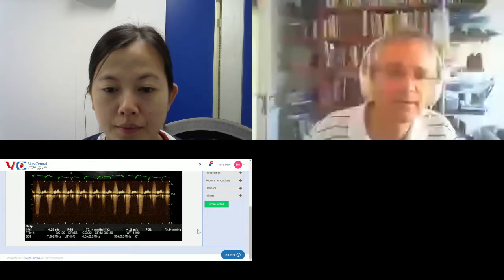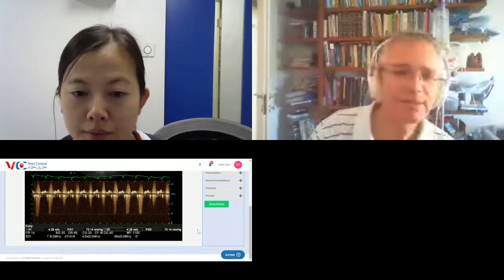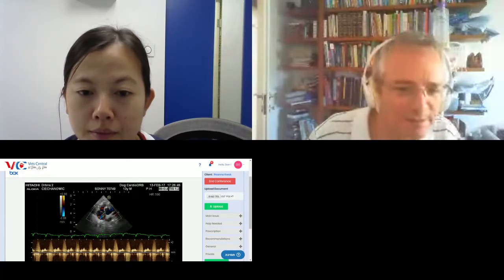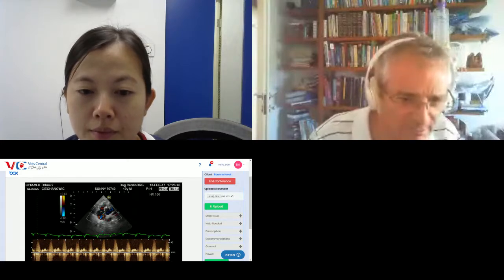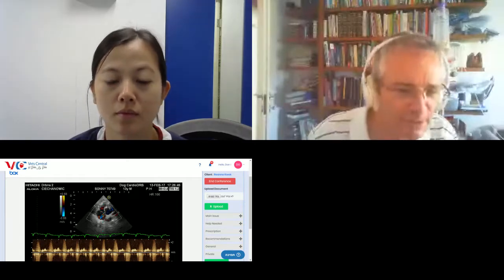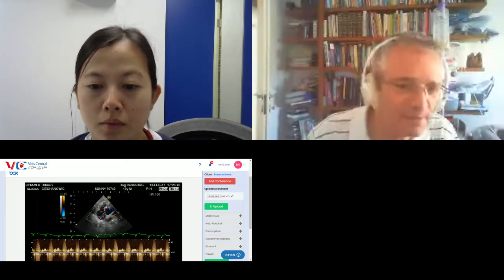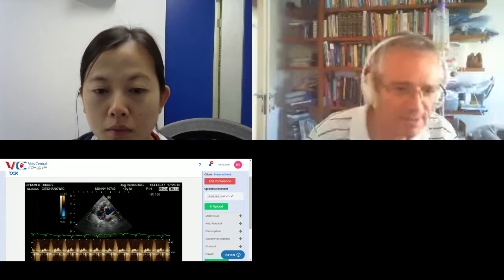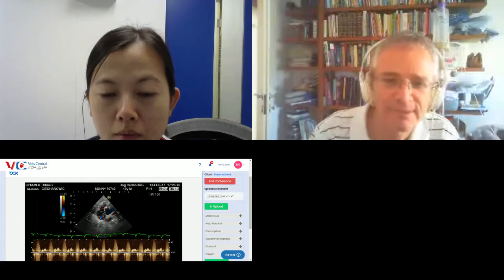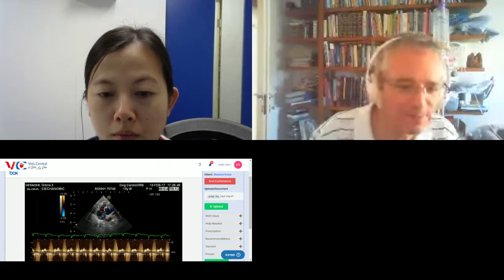I think this circle now encircles the right atrium. The middle of the circle shows you a very small portion of the tricuspid valve leaflets, out of which comes a very narrow colored Doppler jet. It goes from the top of the image to the bottom. If I'm correct about the location, which I have yet to prove to myself, this means that the spectral Doppler sample volume is in the center of that jet, in the bottom part of the image. Let me come out of this and come back to it so that we can see the bottom part better.